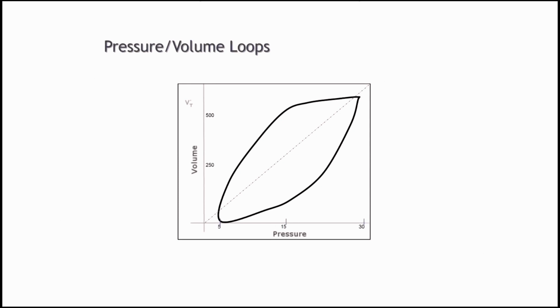Dr. Samavadam's words, basically: usually the pressure-time curve and the flow-time curves are very, very important. And the loops, maybe we can always discuss. We can get some information, but how useful it is going to be, I think we need to interpret the reports as per the individual clinical situation.